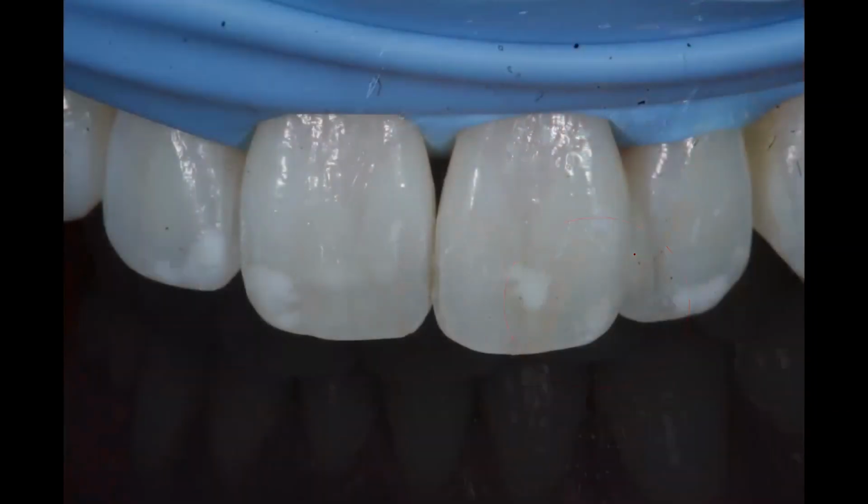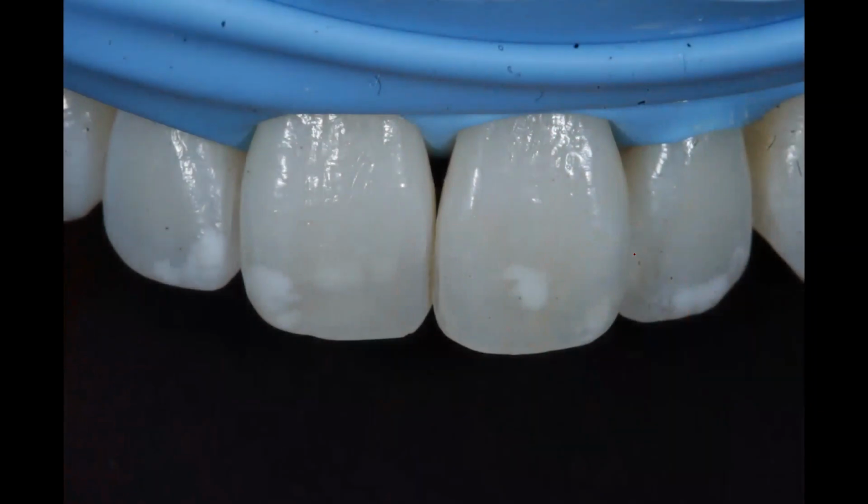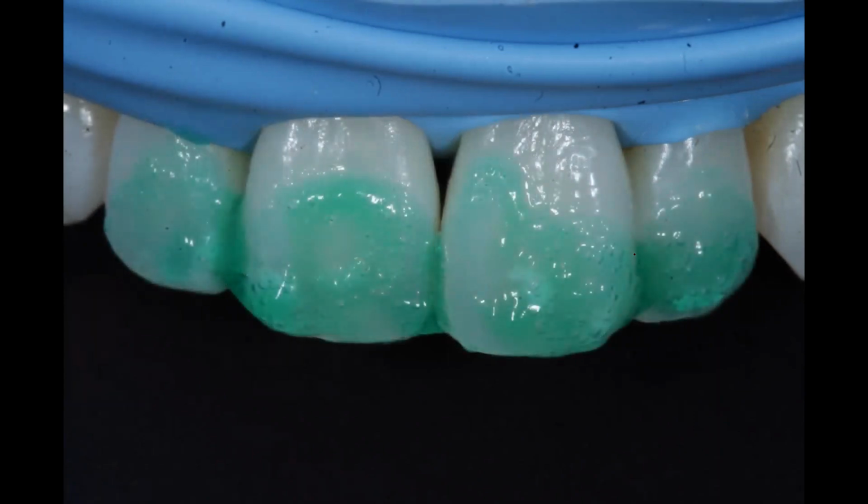So anyway, isolate the teeth. By the way, these pictures will have a lot of muck in the lens. The lenses need a clean, it's got a few hairs in there and that sort of thing, but that's just how it is. In terms of the teeth here, we isolate first of all, and then we apply the etch to the teeth. Left this on for 2 minutes, just to try and remove a few things.